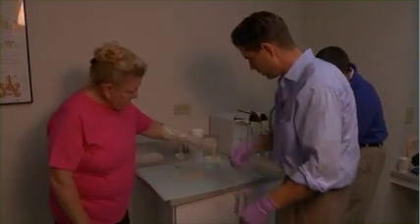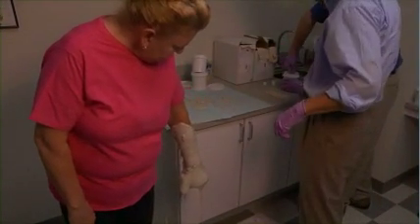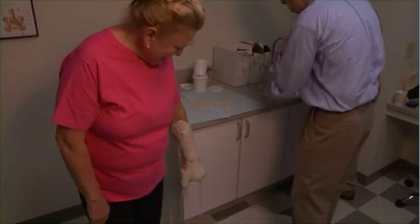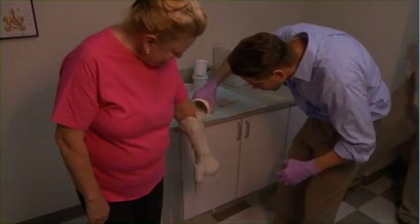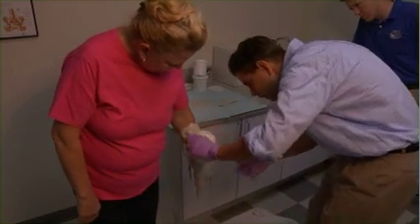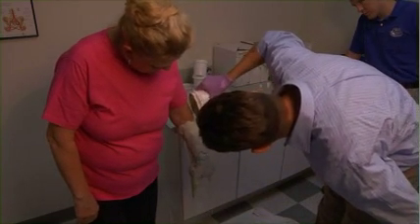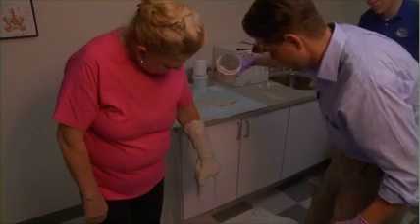Now just come out over the mat and hold your arm straight down. Wonderful. This would be good for Halloween — you can already imagine standing at the front porch with that on. Let's just go with that. I want to get this part of the arm — see if we can bridge this a little bit here. Relax your arm down a little more. I think it's going to be good. I think the thickness is good. You wanted a good three millimeters, so I think we've achieved that. Just stay relaxed.